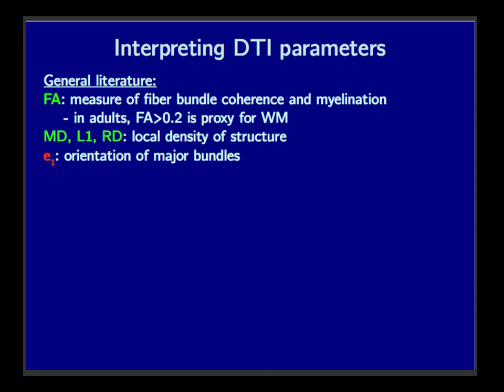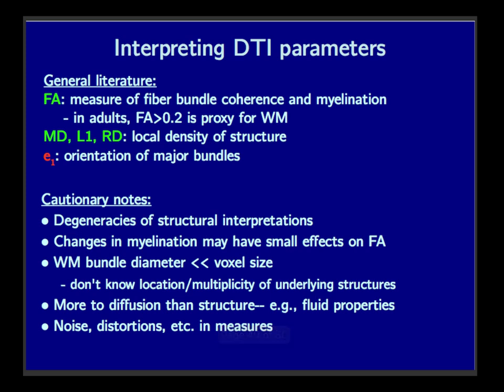Does that make sense for how I'm relating these things? Okay. Now, in reality, those are kind of cartoon pictures. Reality is much more complicated.